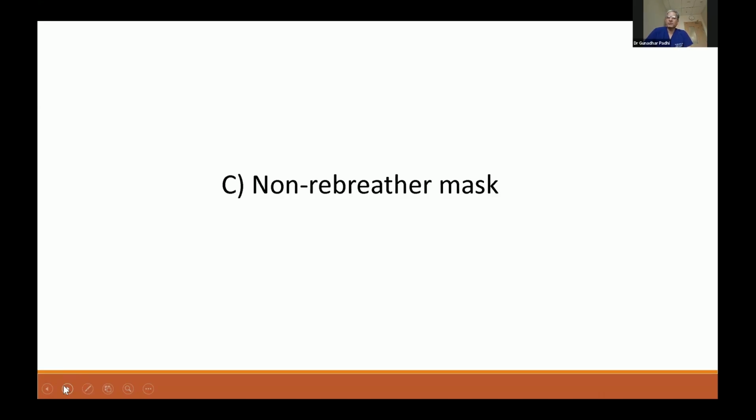In a lot of patients, if the valve is not functioning properly or they don't use it properly, there is always a chance of carbon dioxide retention. That is another issue. CO2 retention is always an issue, and you have to look for it in such patients when you give a very high concentration of oxygen. That is the reason when you give the patient a non-rebreathing mask, you should be standing beside the patient and monitoring. And as far as possible, you should avoid giving 100% oxygen, unless it is a dire life-saving situation where you really want to give 100% oxygen.